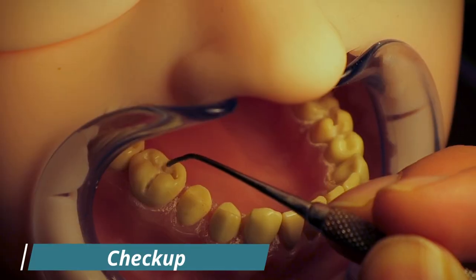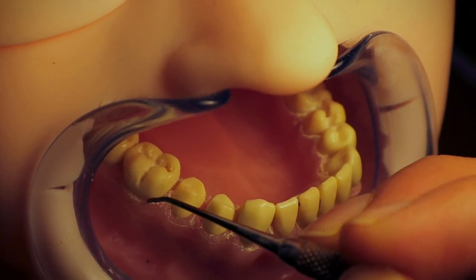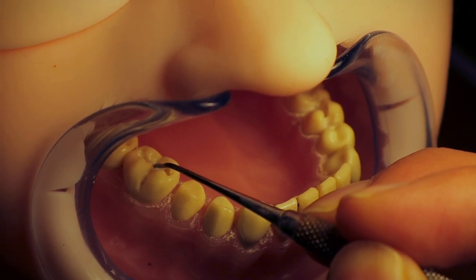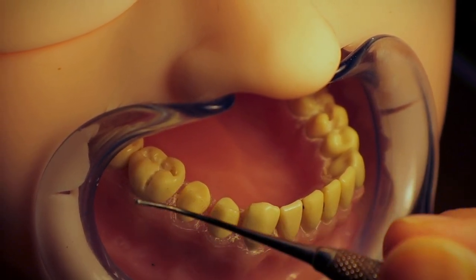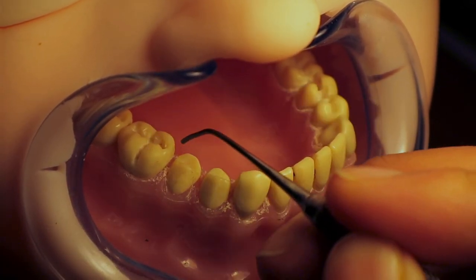The first thing I did was check for pain on percussion, then we checked for inflammation around the tooth area. Then we checked for tooth mobility and determined it was grade one mobility — so it wasn't a very mobile tooth. The tooth in question was the LR6, or the lower right six, which is the mandibular first molar.